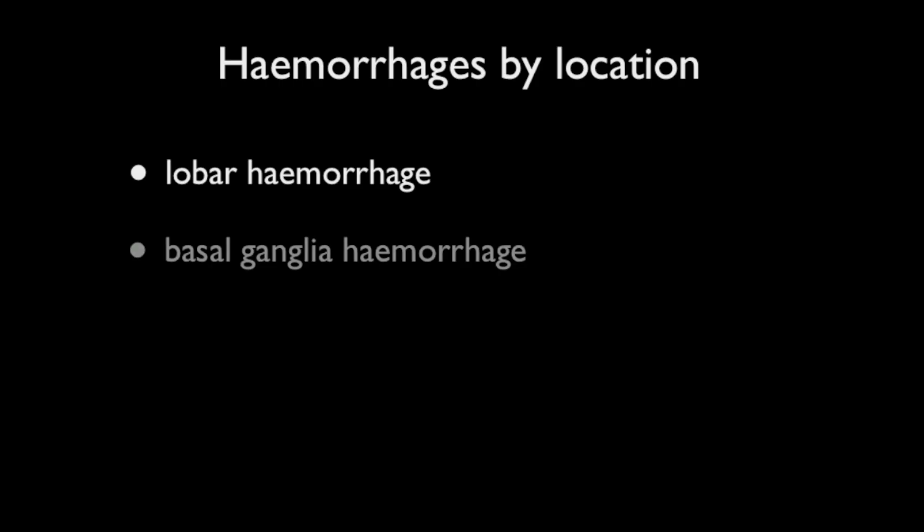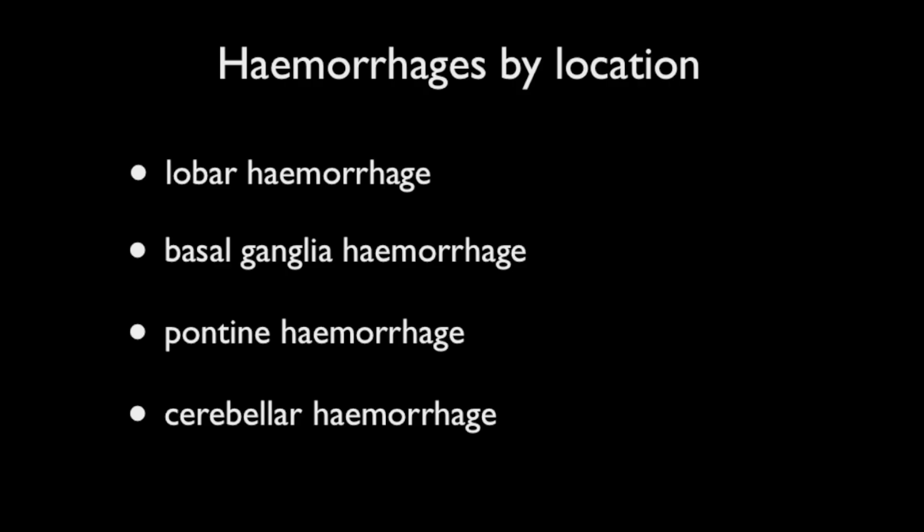Intracranial hemorrhages can also be divided according to location. Generally these are thought of as lobar hemorrhages located within the cerebral lobes superficially, basal ganglia hemorrhages arising from the grey matter of the basal ganglia and thalamus, and pontine hemorrhages.